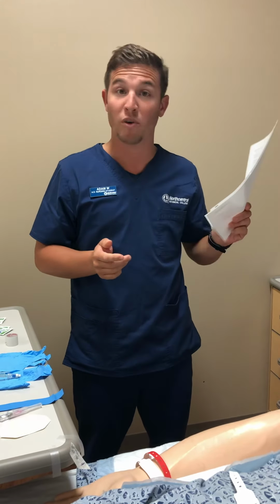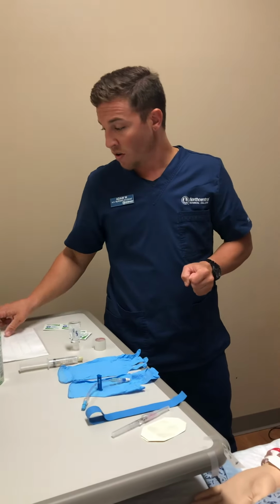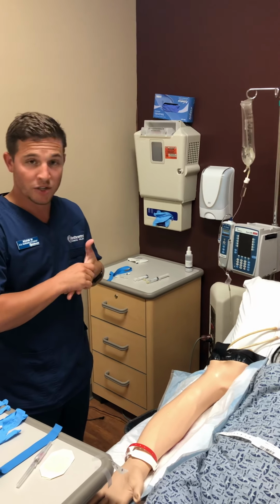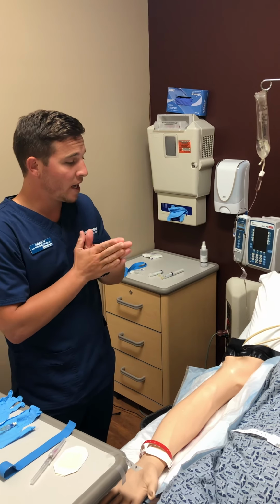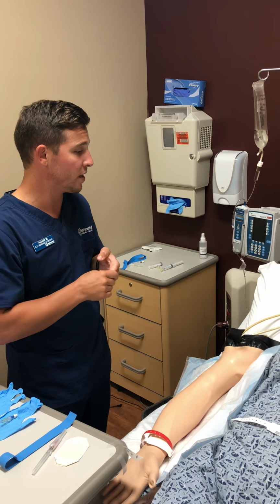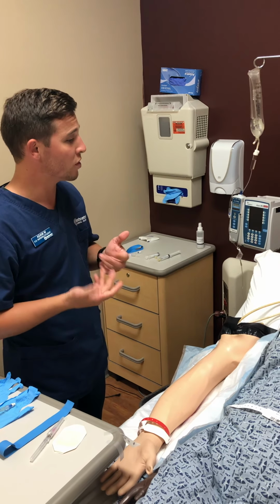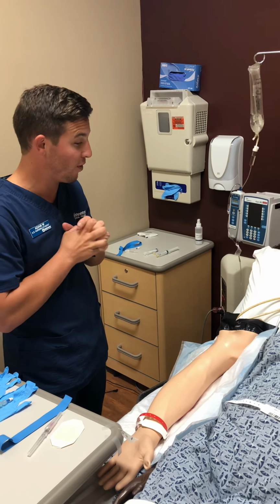Okay, Mary, do you have any allergies? She says yes. She tells me morphine. That checks out. Do you have any other allergies? She says no. Okay, so we have a procedure. We need to insert an IV, okay? Have you ever had one before? She says that she has. She's familiar with the procedure. So it is a needle that'll be inserting into your arm, and what that needle's inserting is a catheter, which is a tubing, and we're gonna leave just the tubing in, not the needle. We'll keep that in so we can give you some fluids. Your doctor ordered fluids because you came with dehydration, so we're going to correct this problem for you, okay?